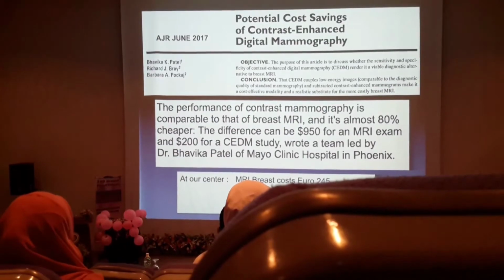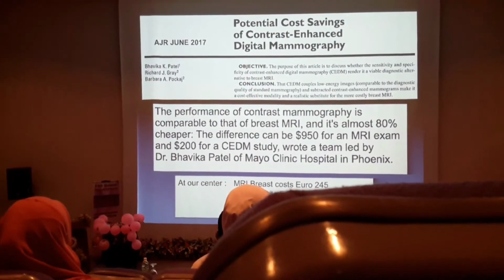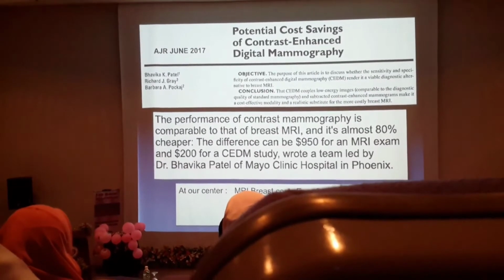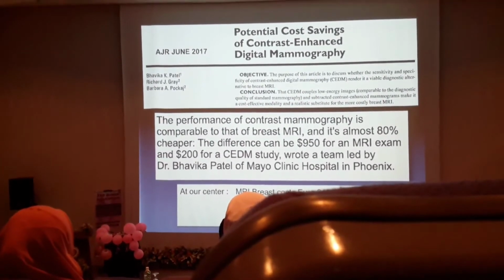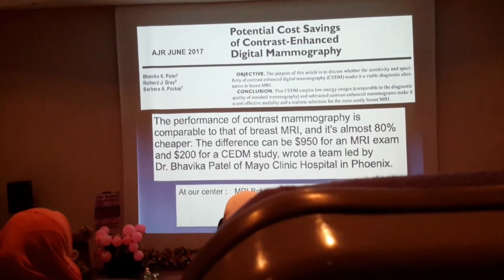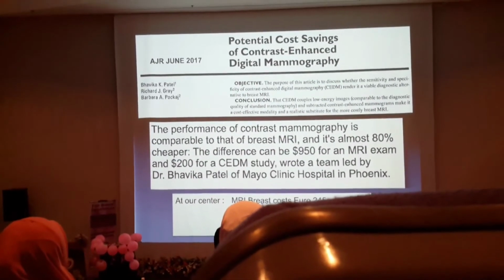And when I was in Italy, we did an estimate, and a breast MRI cost 245 euros. However, contrasted mammography only cost 95 euros. There was a 40% decrease in the amount spent for a contrasted mammogram.